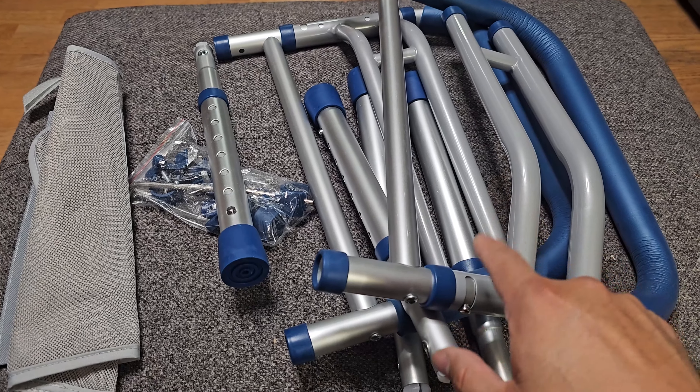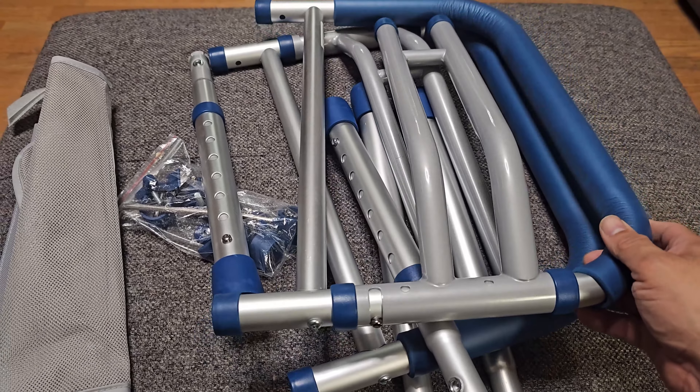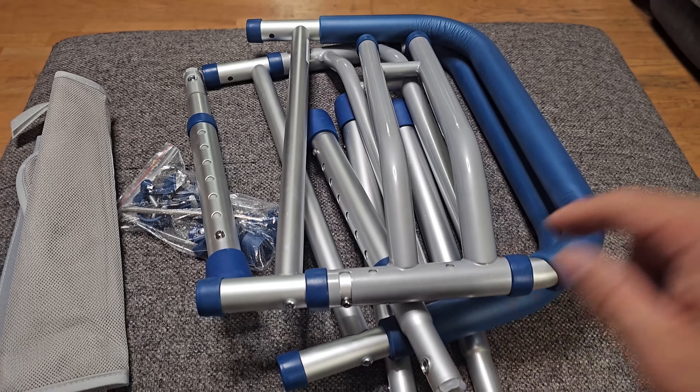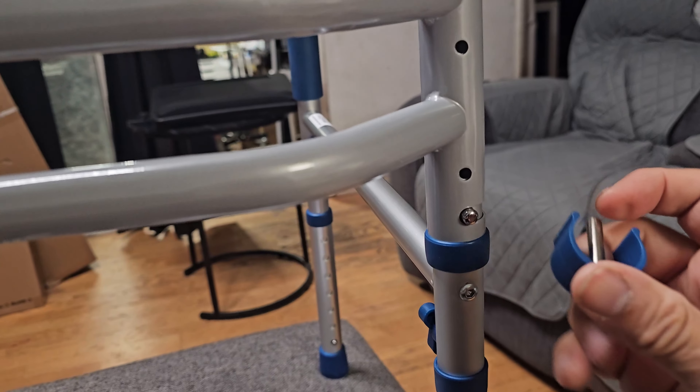This is how it comes — compressed in a box, everything well secured. Instructions are included, no tools necessary, and everything you need is included in the box. Let's put it together.